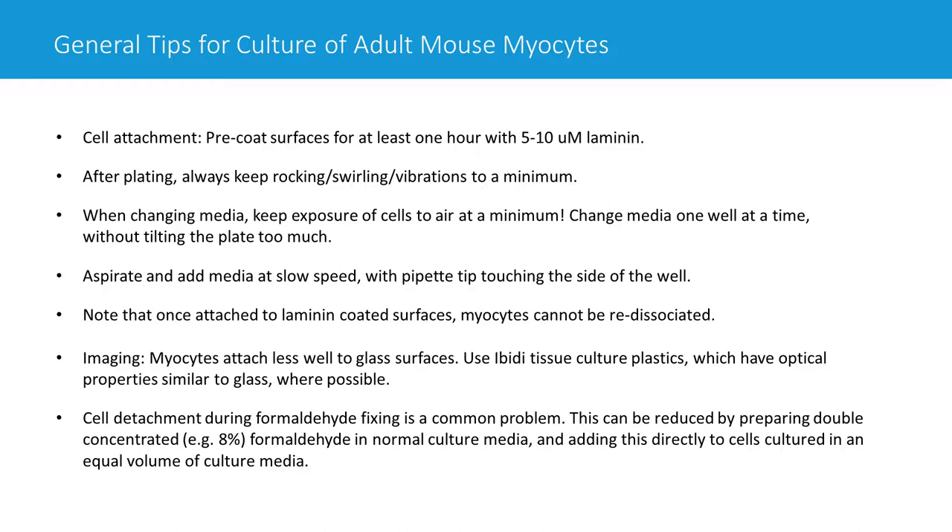Another issue: when people try to fix cells with formaldehyde prior to imaging, the cells will often dislodge. Rather than aspirating media and adding formaldehyde-containing buffer back, we prepare double-concentrated formaldehyde. If the final concentration should be 4%, prepare 8% in culture media, then slowly add this directly to the culture media the cells are already in — in an equal volume — so the final formaldehyde concentration is 4%. Leave that for 15 to 20 minutes for cells to fix. You should have fewer cells falling off this way.